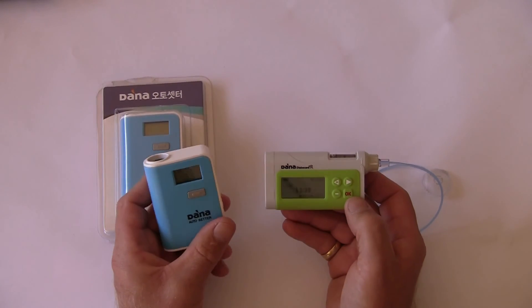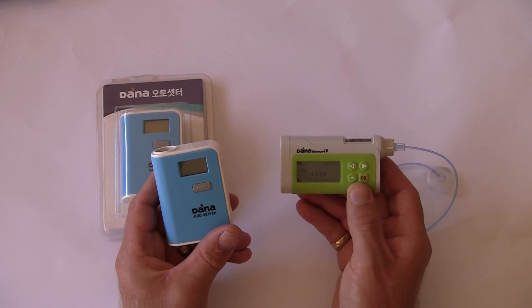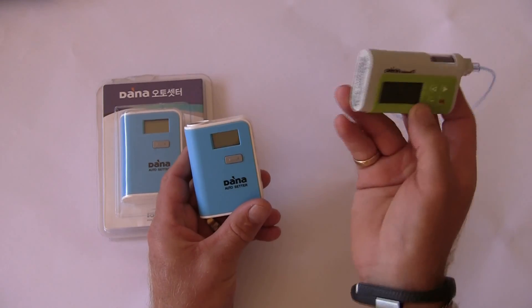We can go end with one button press on the Autosetter. So when we come to refill the Dana insulin pump, the information will automatically be transferred via secure Bluetooth from the Autosetter to the pump.